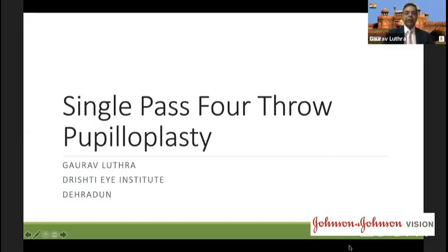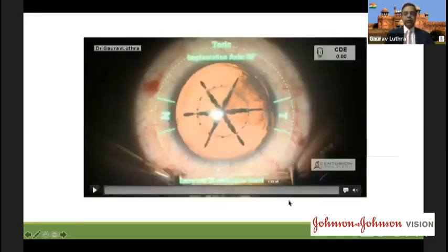I'll be only showing you the basic technique of the single pass four throw pupilloplasty. And that will then take you on to a couple of other new innovations, which Dr. Amar and a couple of other people will be describing. So I wanted to show you a few videos.